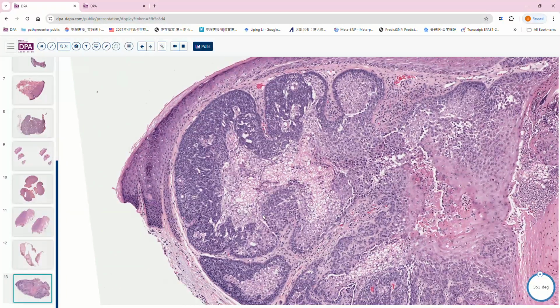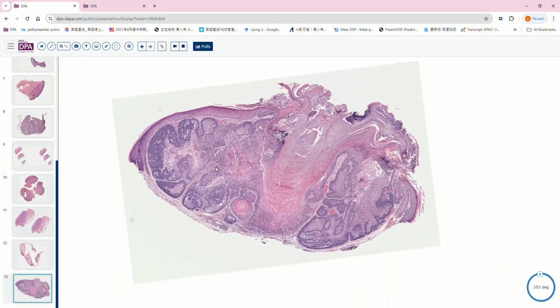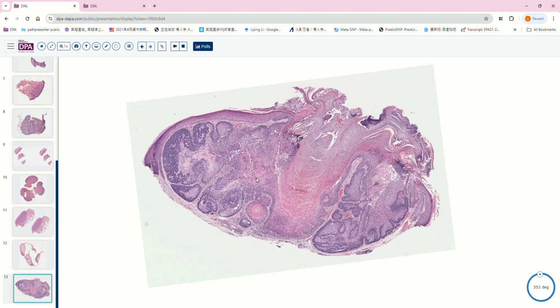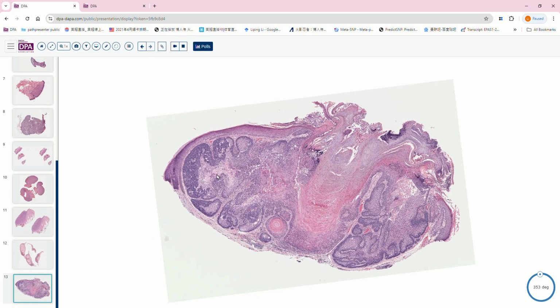You're absolutely correct. Whenever we see this bubbly cytoplasm, other than all the clear cell cytoplasm diagnoses we already talked about, it could be sebaceous differentiation, especially if we can see some kind of hair follicle thing happening here. So this is a sebaceous adenoma. Whenever you see this sebaceous differentiation, you should always put some differentials, because sebaceous adenoma is one of them. The other one is sebaceous hyperplasia, and some other diagnoses are Fordyce gland, sebaceoma, even sebaceous carcinoma. How could you tell the difference between all of these?